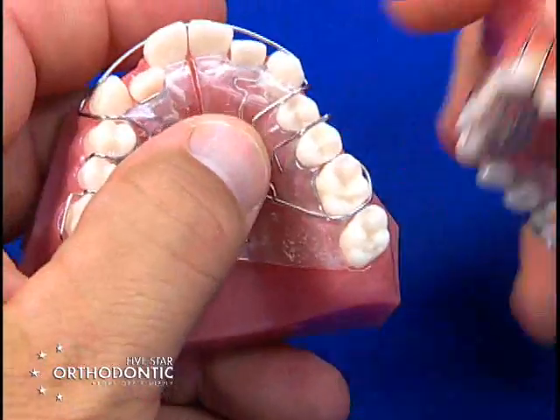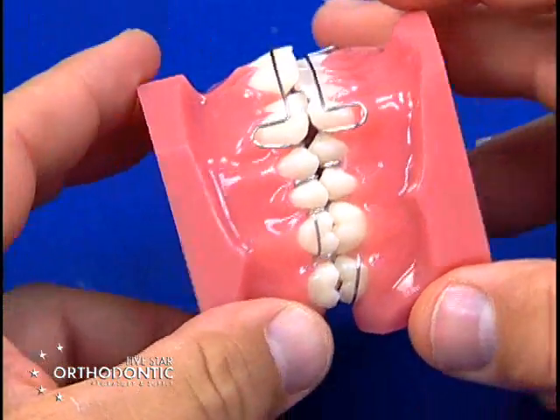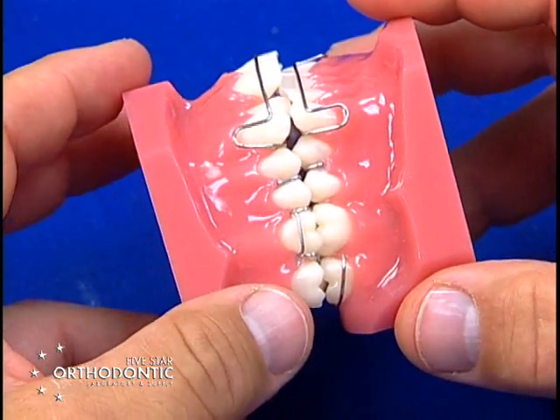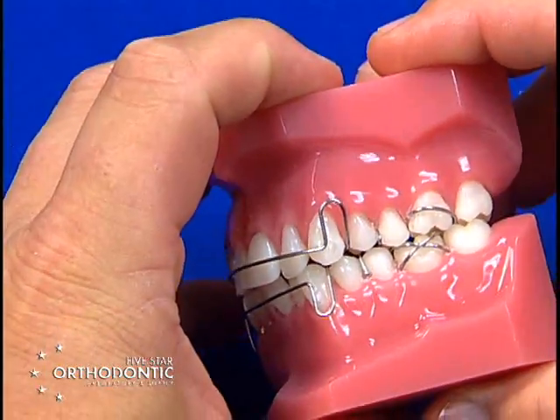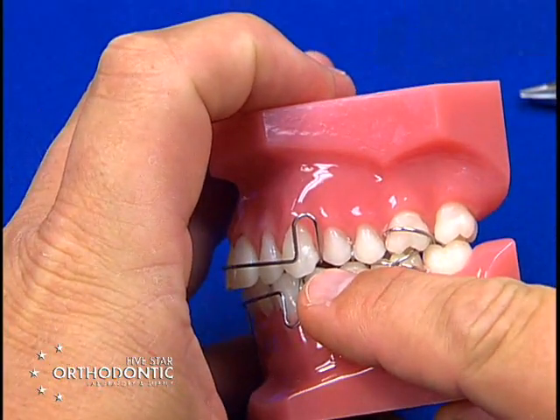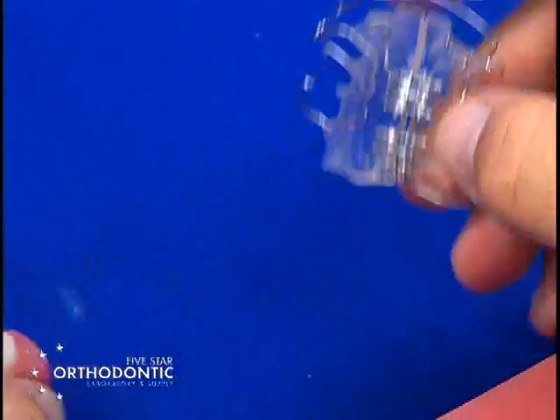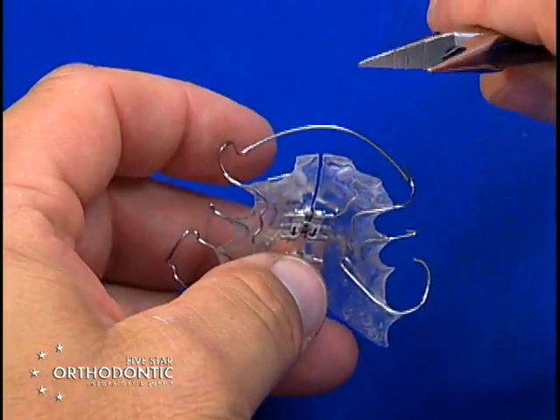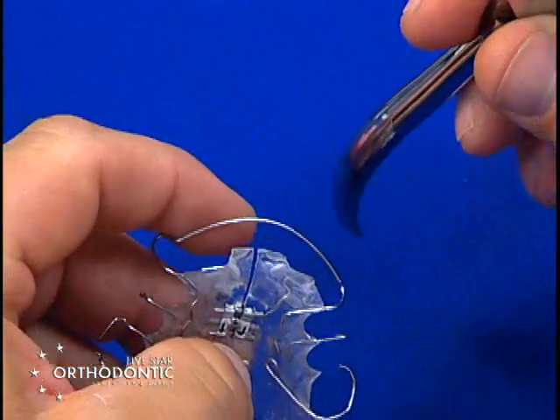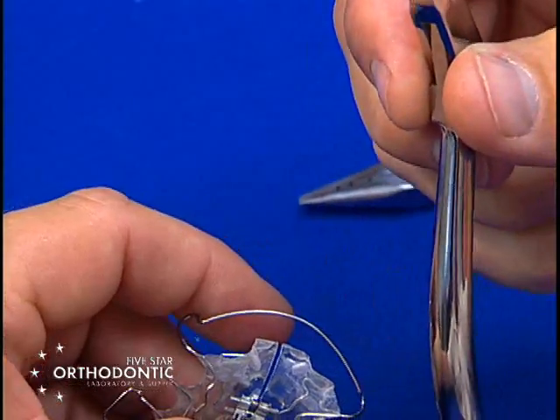Many times when you get a labial bow and start your expansion, the occlusion may get in the way. Your lower cuspid may hit the labial bow as it crosses the occlusion. In this set of typodonts it does not hit, but if the bow is hitting in this section you can take a flat-on-flat — two flat ends.